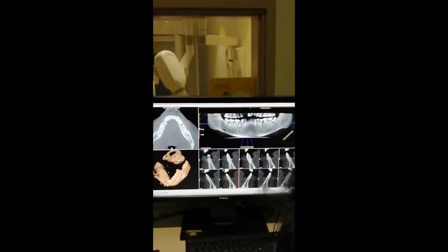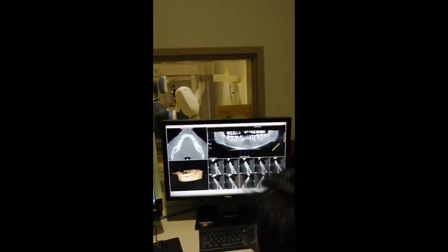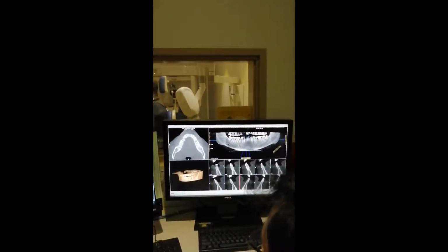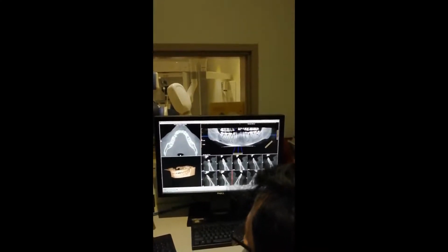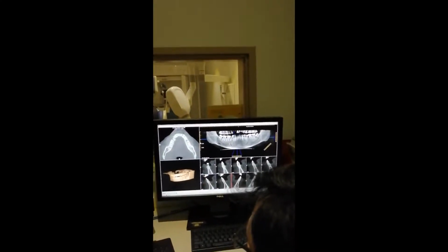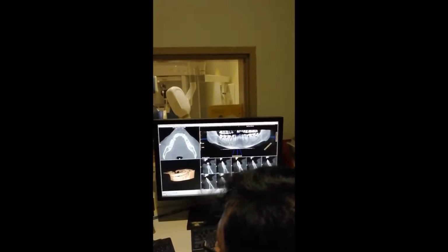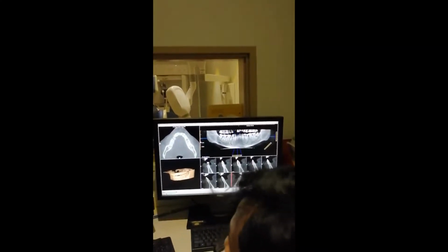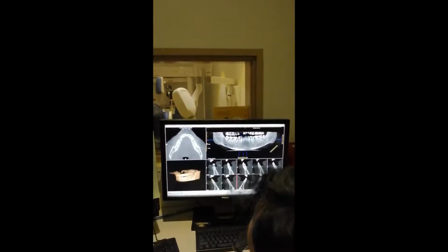See? Okay. Cone cut. Cone cut. Doctor. Cone cut. Which tooth you wanted? Premolar. 4, 5. It has come, no problem. But apex little bit missing. That's fine, I think. Who is doing? Me. No, not you. I mean, root canal. Doctor me. Oh, okay. Show him first. Should be enough, I think.